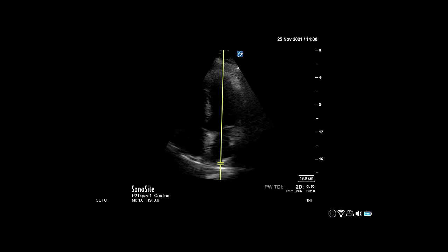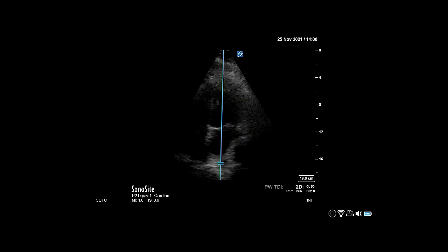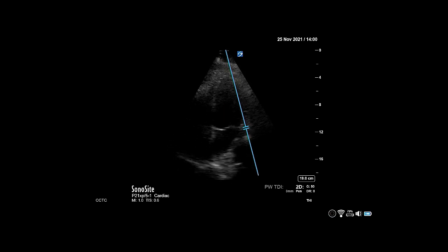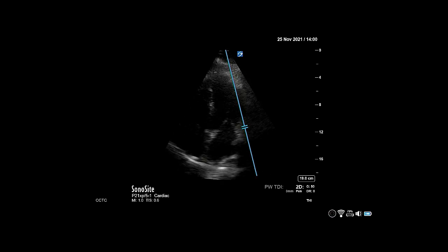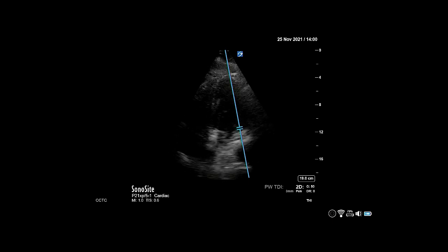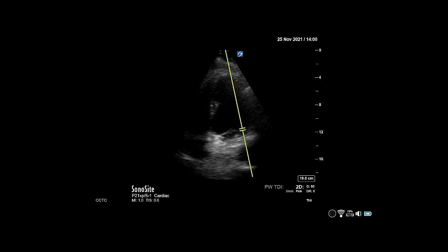For the lateral wall, place the tissue Doppler pulse gate just at the annulus of the mitral valve. This will give the waveform at the bottom of the screen.